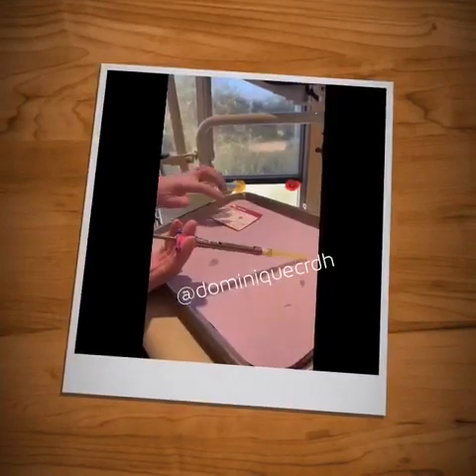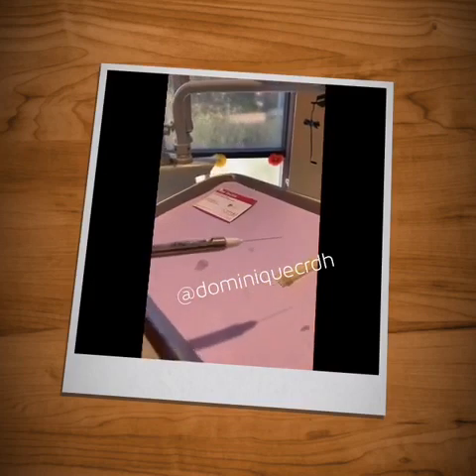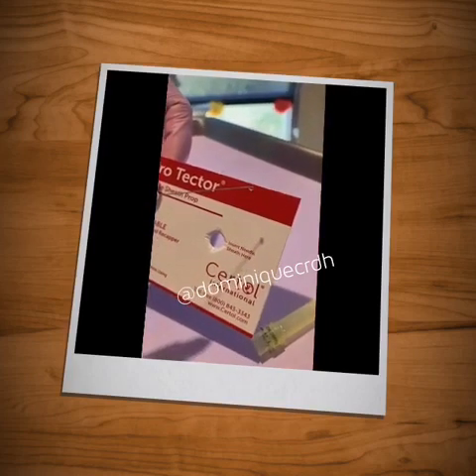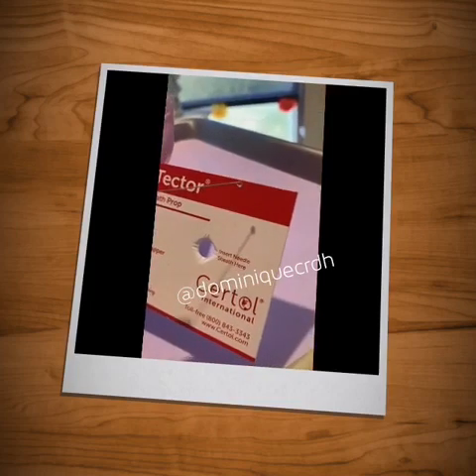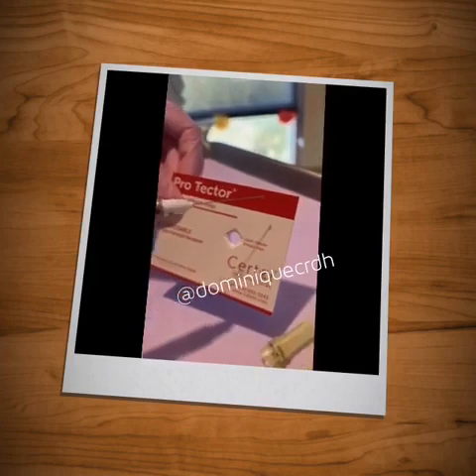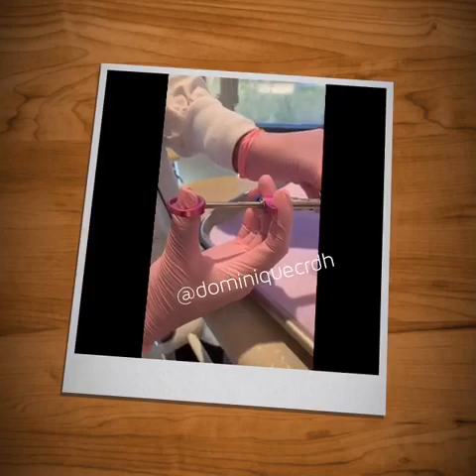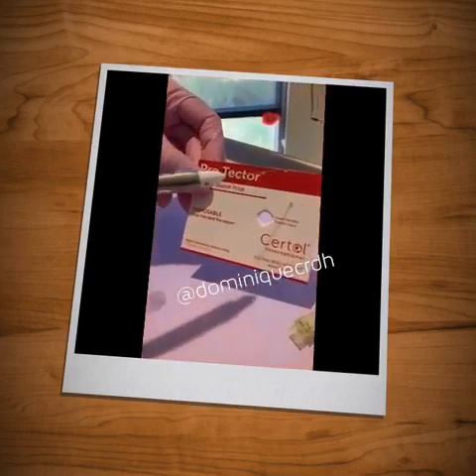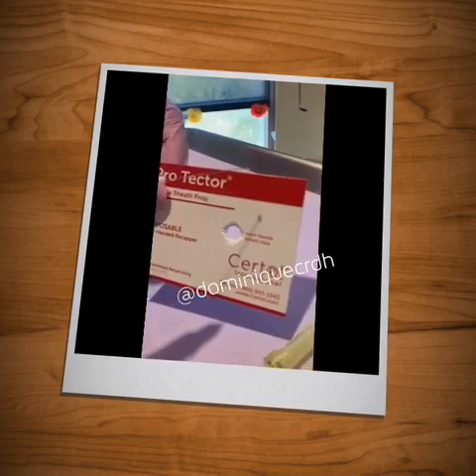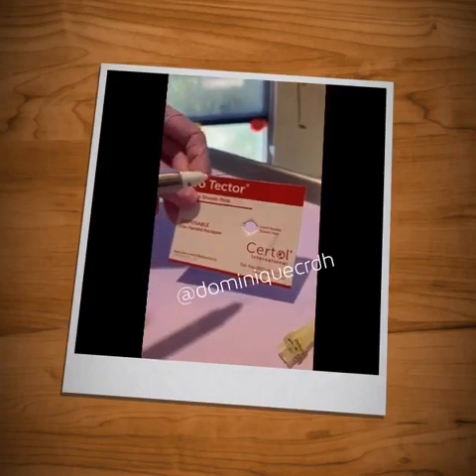To safely remove the cap of the needle, if you don't have a shield protector, you can just grab onto the cap of the needle, push back, and drop the cap onto the tray. And then you want to perform the aspirating test. I want to go over this a little bit more with you so that you can see specifically how to perform this. Again, you just want that small little droplet of liquid to come out the tip of the needle, and you accomplish this by simply pushing slightly on the thumb ring. To aspirate, you bring your thumb back, and bringing your thumb back after you have pushed out the small drop of liquid is going to bring the liquid back into the shaft of the needle. And this is a really important step.